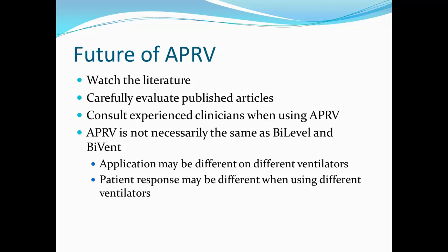I think that the effect on the patient is very different depending upon the ventilator, depending upon the responsiveness of the inspiratory solenoid valve, depending upon the resistance of the expiratory valve, also dependent upon whether or not the time low is truly fixed or whether or not it can be extended by the patient if the patient's peak expiratory flow rate increases. I think we need to be very careful with some of these modes that may be similar but not the same as APRV.